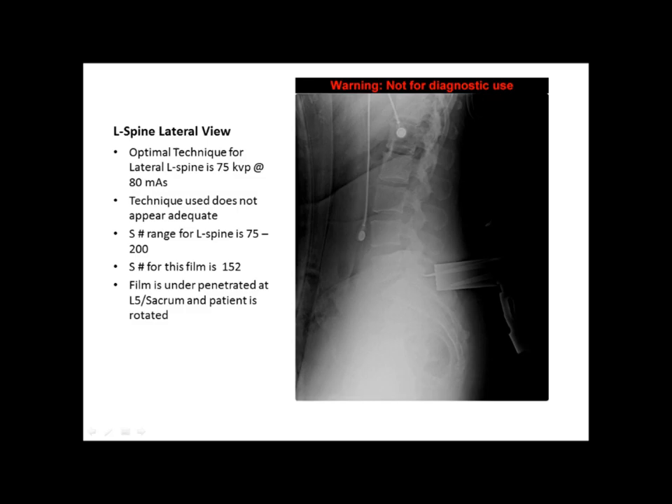The next film is a lateral L-spine. The optimal technique for a lateral L-spine is around 75 kVp at 80 mAs. The technique used on this particular film does not appear adequate. The L5-sacrum area of the film appears underpenetrated. The patient is rotated, but the film was taken in the OR so it's understandable — you can't do much because the patient is in a sterile field. The S number range for L-spine is between 75 and 200, and the S number for this film is 152, so it's in range.